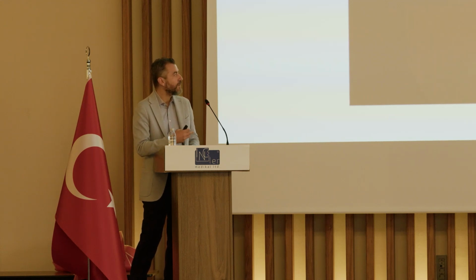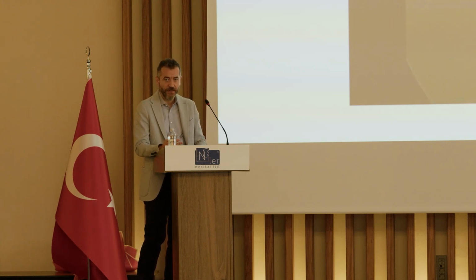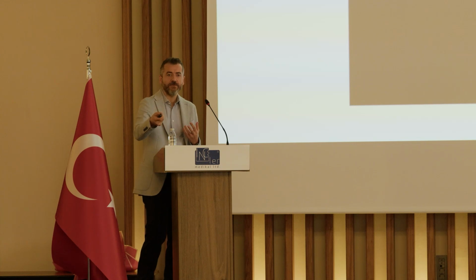But also, a good device should be operated well. This is very important. And usually when I have some guests in my department to show the procedures, or when I visit them in order to give some technical operation details, in the end, these lithotripsies are not magic words. I mean, you need to apply them appropriately. If you just stick the probe at the very center of the stone and push the pedal, it doesn't disintegrate, it doesn't do anything. In the end, you need to know how to apply it.